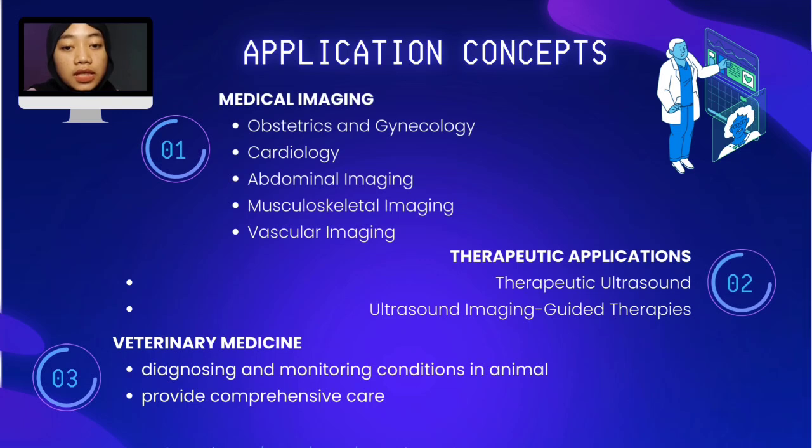Another application is therapeutic applications. This application has 2 sectors. First one is therapeutic ultrasound. High-intensity focused ultrasound (HIFU) is used for non-invasive tissue ablation in the treatment of tumors, uterine fibroids, and neurological disorders.